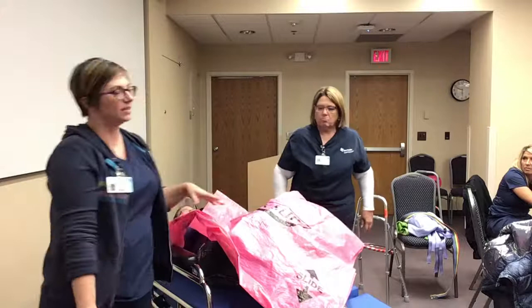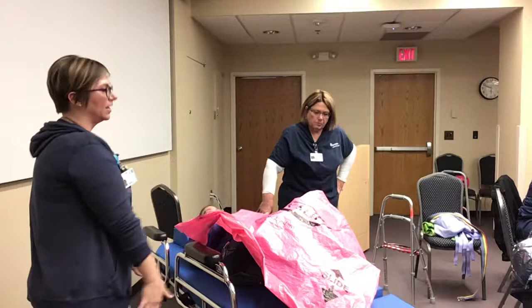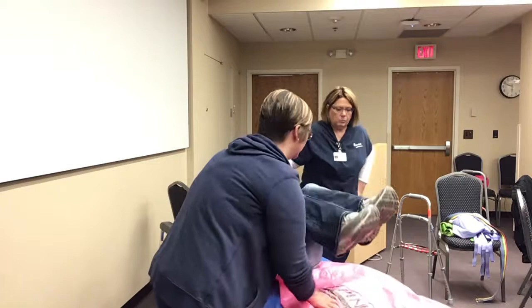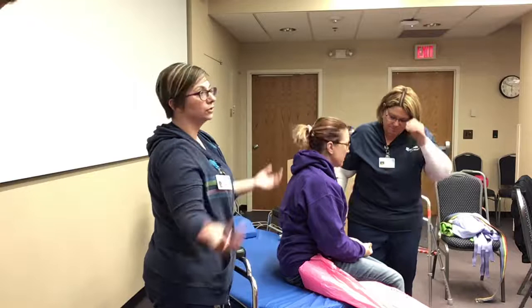Getting the patient's legs out of the bed — how many times have you had the bed all the way down to the floor, leaned over, grabbed the legs, and pulled them off the side of the bed? Think about how much pressure that is on your lower back. Bring that bed up to your working height — it's completely okay to have the bed up to where you're working to save your back. As long as you're in front of that patient with their knees right in front of you, that's okay. Once they're sitting, then put the bed down so their feet are touching the floor. Use the pink slip — that's what it's there for to help decrease back injury.